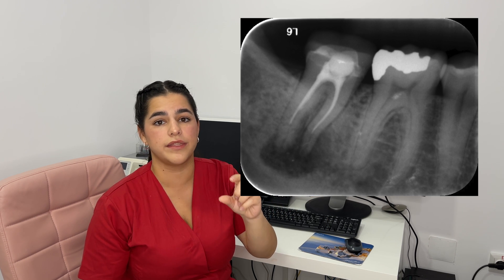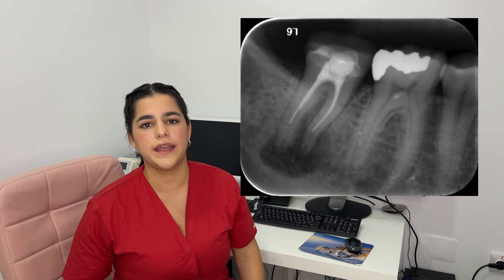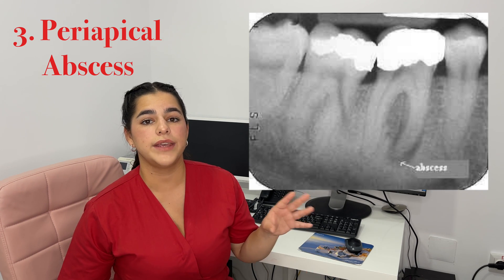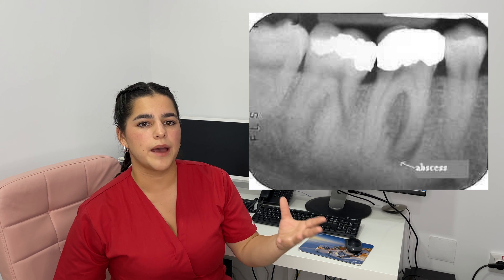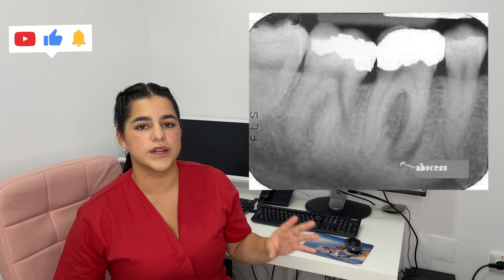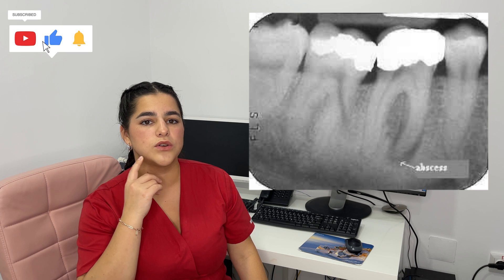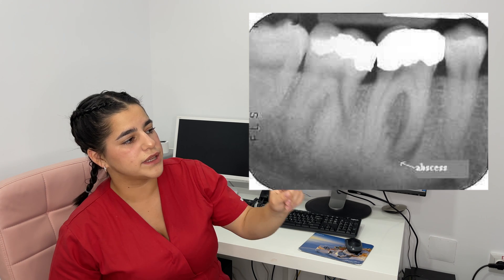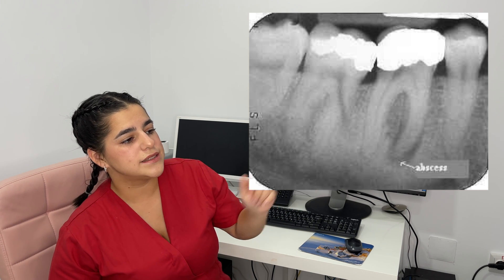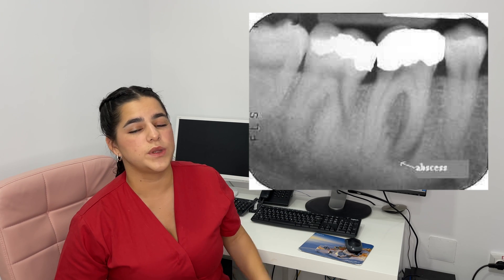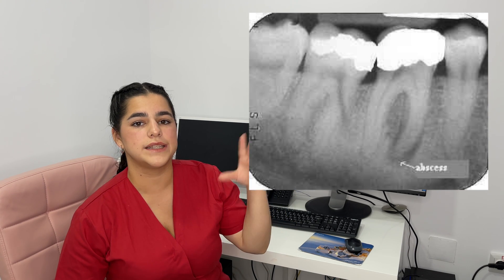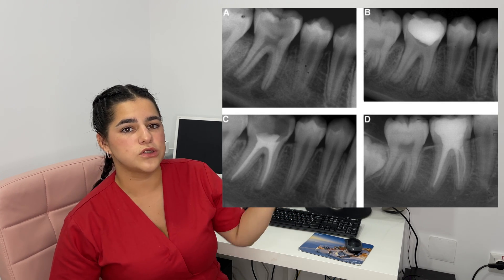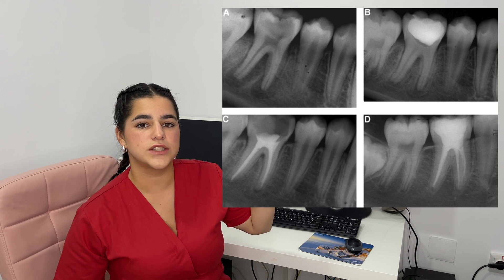When an endodontic treatment doesn't reach the apex, infected pulp remains underneath, resulting in even worse pain, and the patient has to come back for retreatment. Now looking at this case, we can see a periapical abscess — it's around the apex of the tooth. Here we're talking about the lower first molar on the fourth quadrant, tooth 4.6. The abscess appears radiolucent on x-rays, observable around the periapical zone — more specifically around the mesial root. This must be treated with endodontic treatment, including placing a medicament that will allow healing before the final treatment.